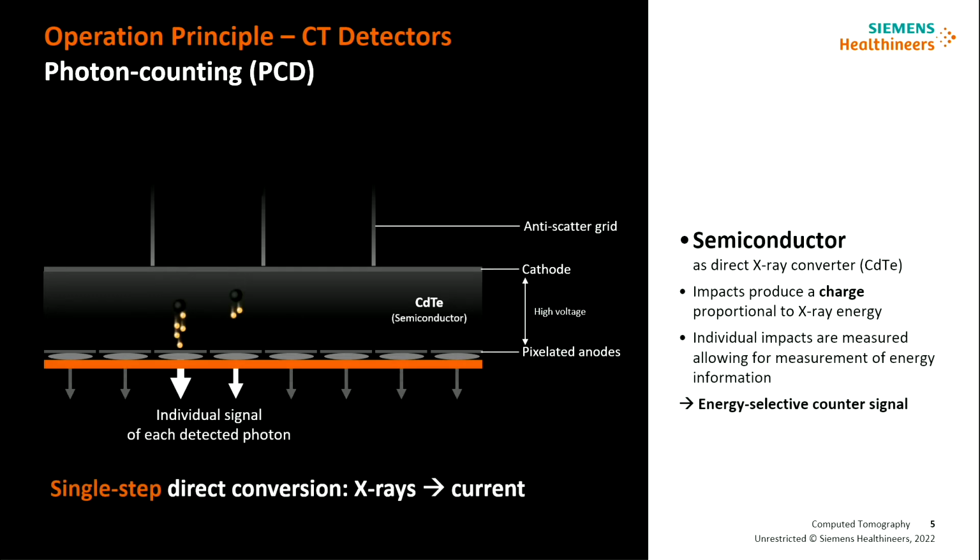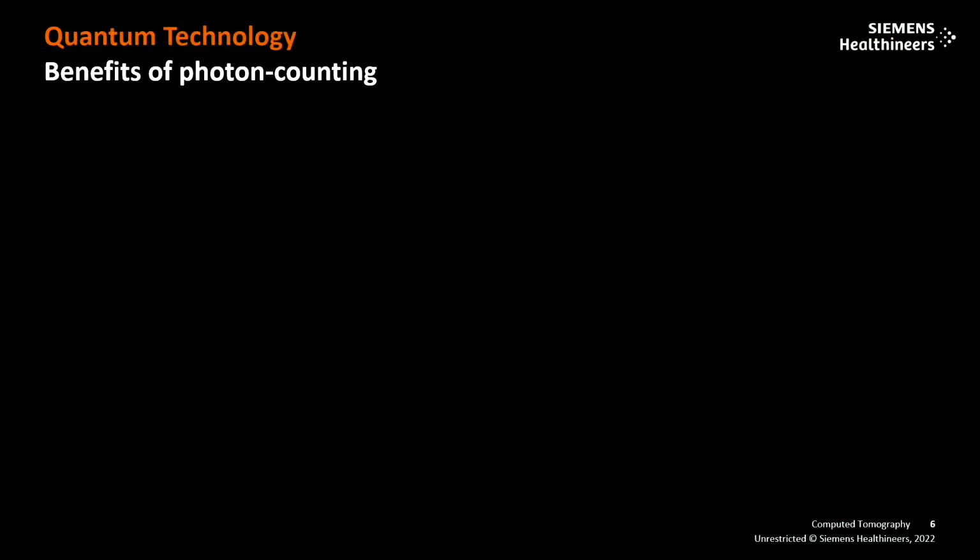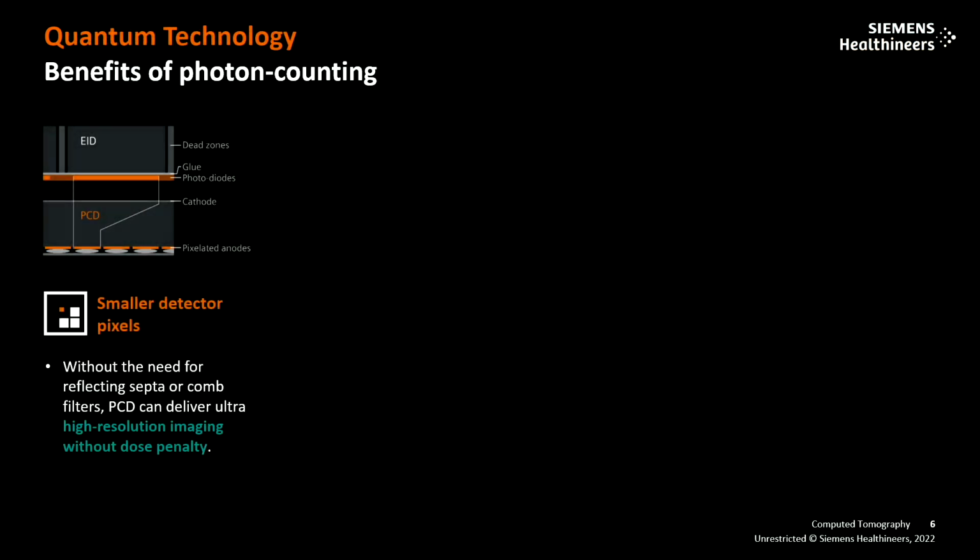The amount of charge that is deposited is proportional to the X-ray energy, so we have the information of each X-ray impact. If you can measure fast enough, 8 nanoseconds, you can measure every individual X-ray, and that's what we've done. Faster electronics as well as smaller detector pixels. And so we have the ability to do those technological advancements that I mentioned.